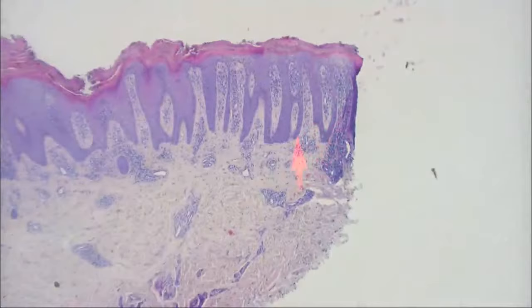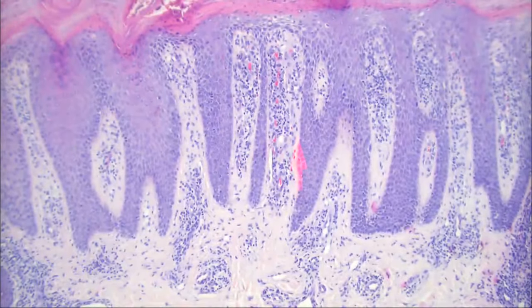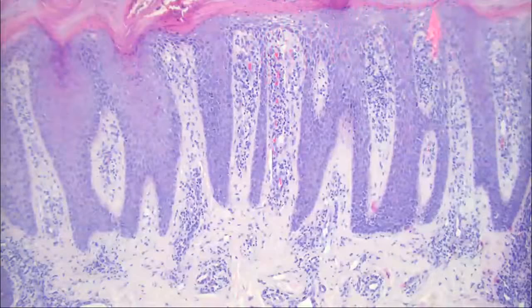Maybe thinning of the suprapapillary plates. I see vessels, maybe. And then the vessels go up the papillary. Yeah, there's dilated blood vessels. There's thinning in the suprapapillary plates. You said there's parakeratosis.